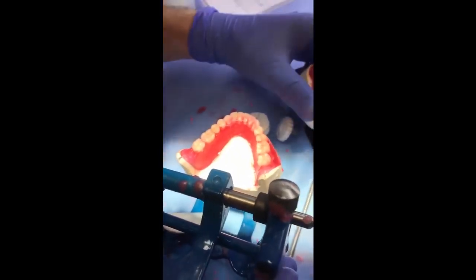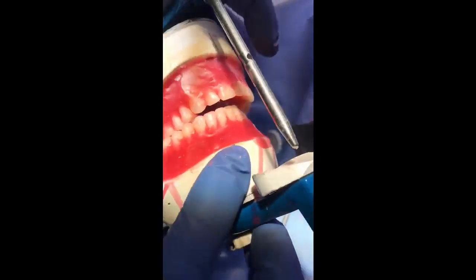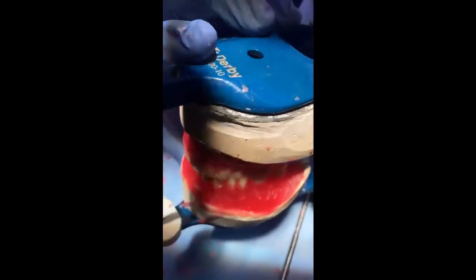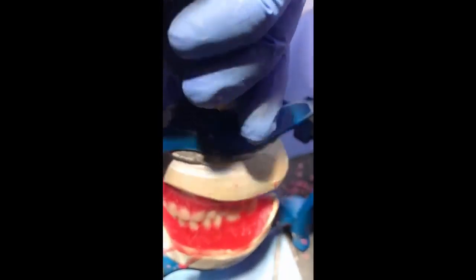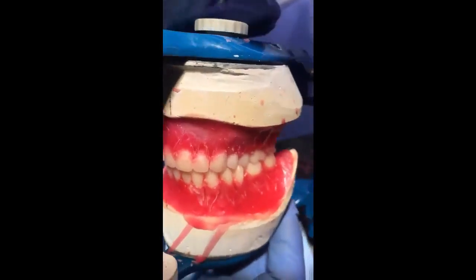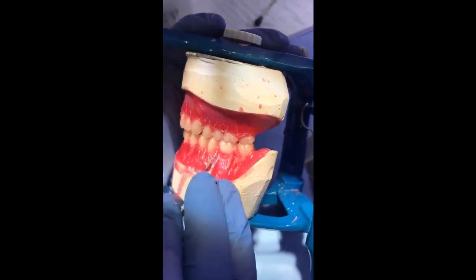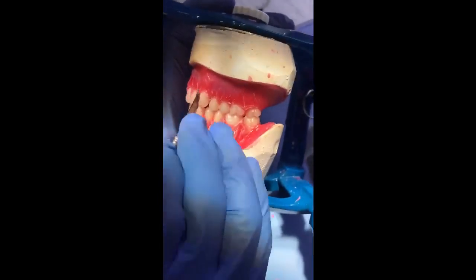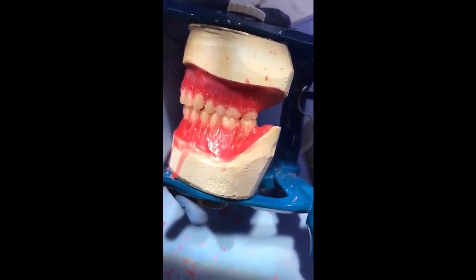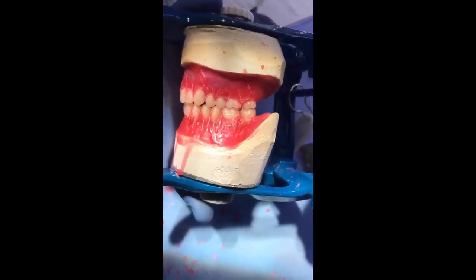Now we bring back the upper cast and close the teeth together again, and we check the centric occlusion. We can use wax solvent to remove the scratches from the surface of the wax and to get a smooth surface for the wax. By that we have finished the waxing up of the denture. Hopefully you will find it easy. Thank you.